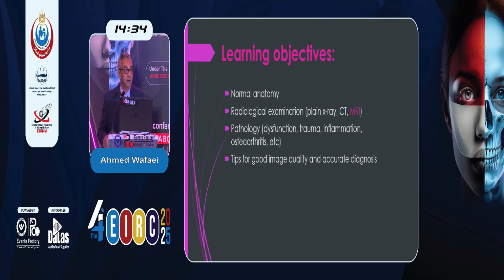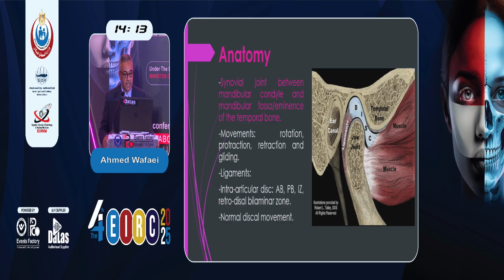The learning objectives are normal anatomy, radiological examination, especially of the MRI, different pathologies of the temporomandibular joints, including joint dysfunction, trauma, fractures, inflammation, infection, osteoarthritis, and tips for good image quality and accurate diagnosis. The temporomandibular joint is a synovial joint between the mandibular condyle and mandibular fossa eminence of the temporal bone. It allows for different types of movements, including rotation, protraction, retraction, and gliding.